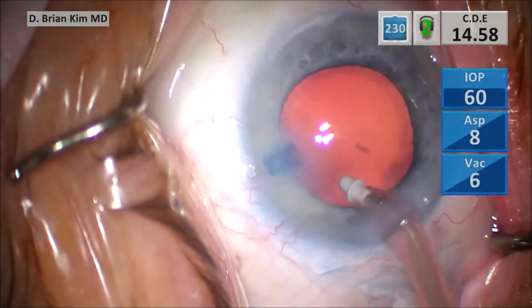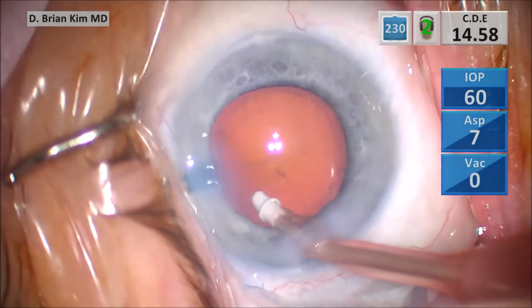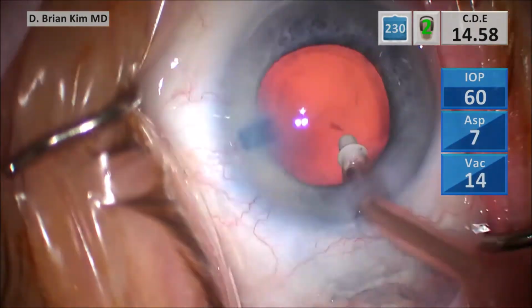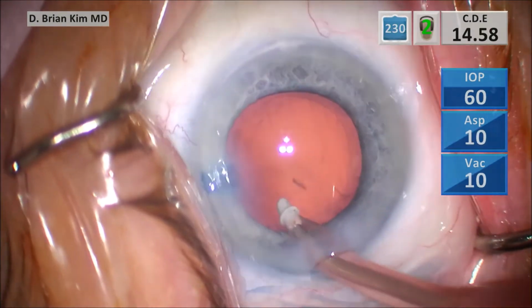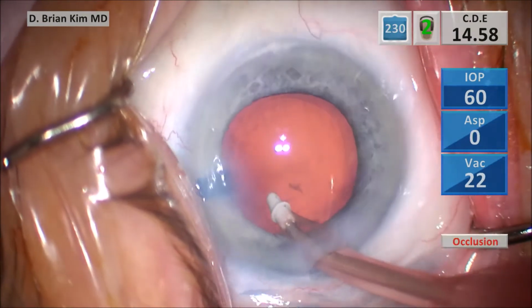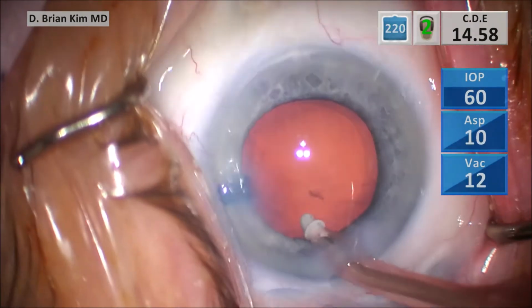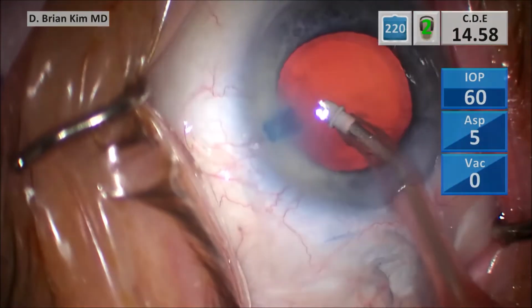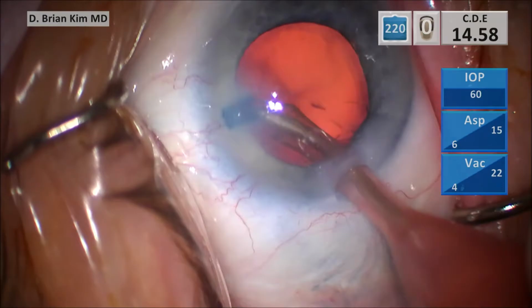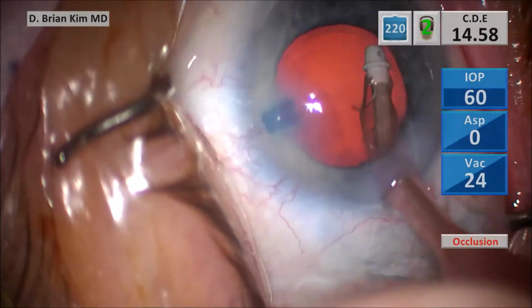So if you only remove what you can see, you're going to leave more lens material than you think you did. So I'm polishing the subincisional posterior capsule as well here. And what ends up happening is these posterior adhesions, like I said, are attached to the forniceal adhesions. So by removing the posterior capsule adhesions, it allows me to more effectively peel the stuff once I get in with the polymer tip in the polish mode into the capsule fornix.